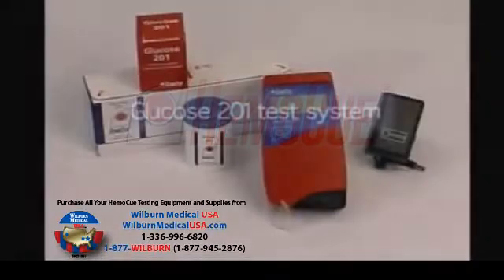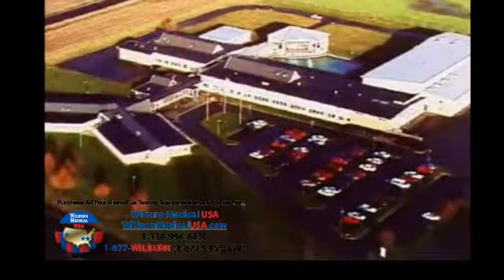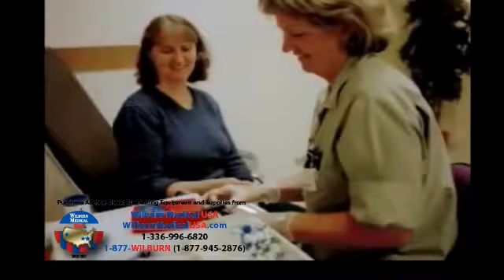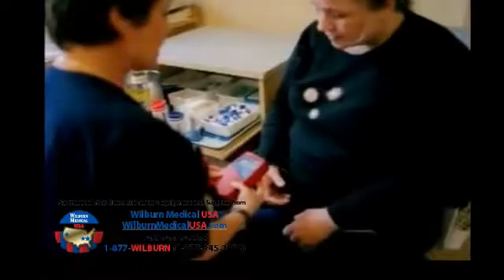HemoCue, a world leader in the manufacture and sale of point-of-care blood test systems, introduces the HemoCue Glucose 201 system. The intended use of the HemoCue Glucose 201 system is for the quantitative determination of glucose in whole blood, supplementing the clinical evidence in the diagnosis and treatment of patients with diabetes, as well as monitoring of neonatal blood glucose levels.